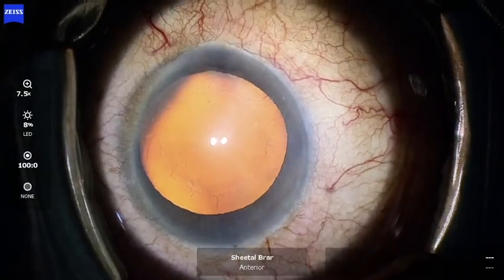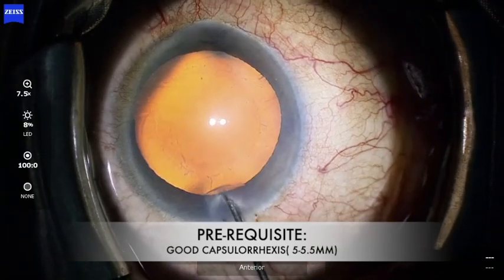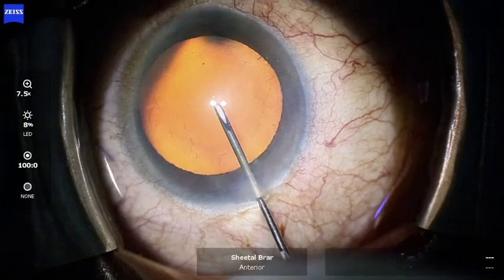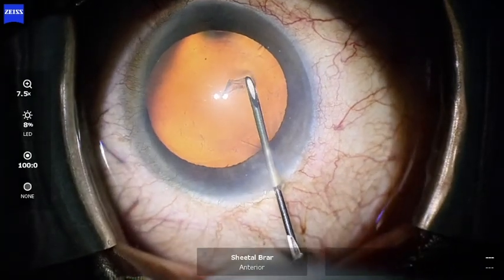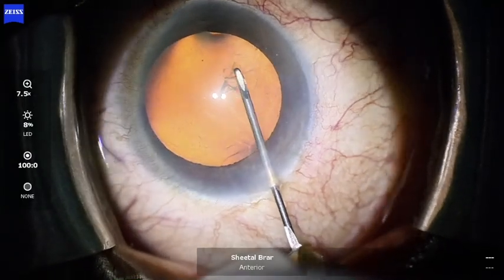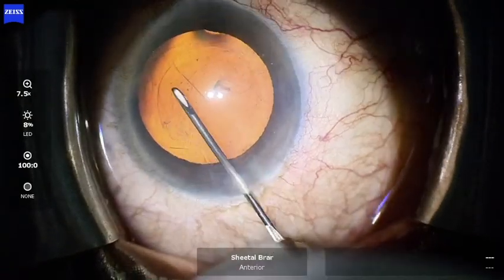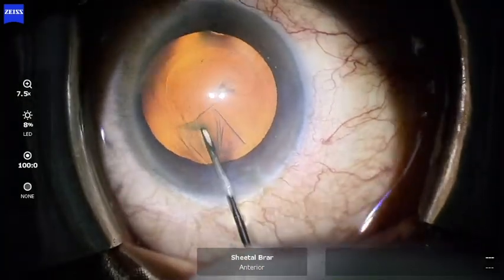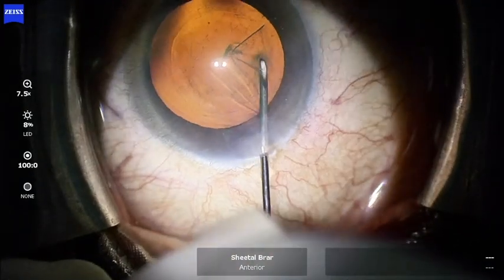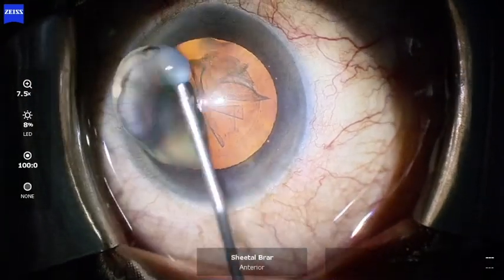An important prerequisite for an ideal trench is making a good capsulorexis. The size of the rexis should be aimed between 5 to 5.5 millimeters. If the rexis is too small, there is a risk that its margin may get aspirated by the phaco probe while sculpting or may get damaged by the chopper in the left hand. On the other hand, if the rexis is too large, the nucleus may keep popping out of the bag while sculpting, resulting in inefficient trenching.